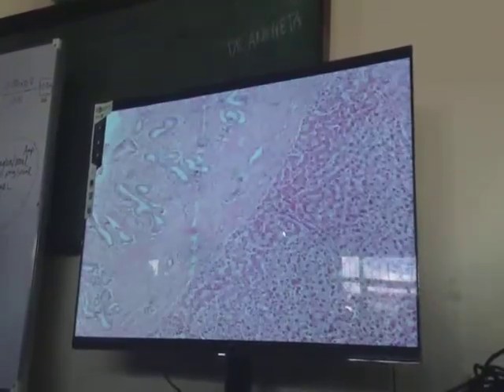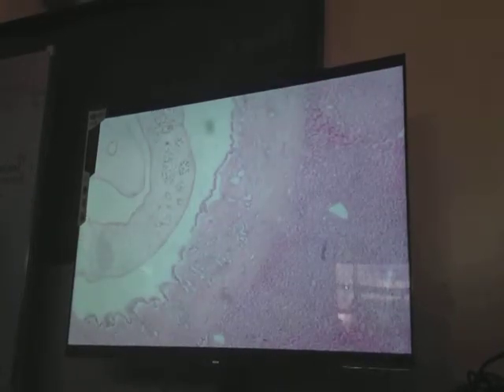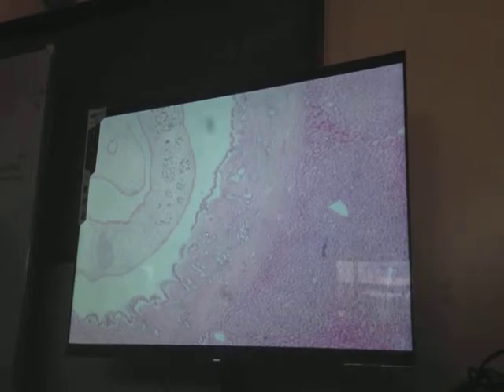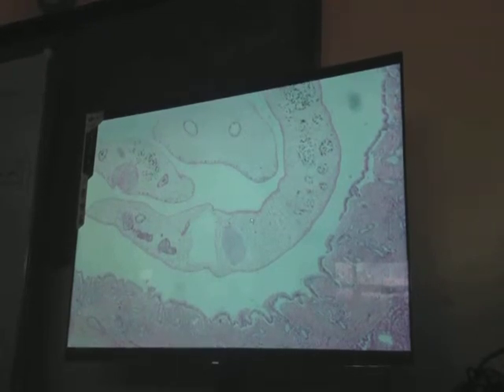What parasitic infection will produce an abscess? You just saw that in parasitology. Entamoeba histolytica. Okay? So, normal liver tissue with a large bile duct inside the liver. Now, inside that bile duct is that parasite. And those are the eggs of the parasite, and the body of the parasite.